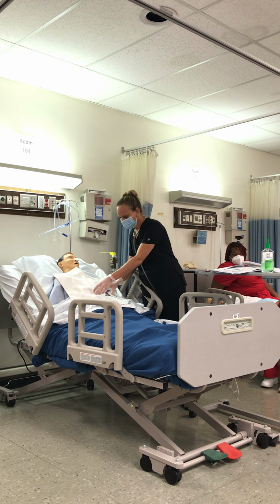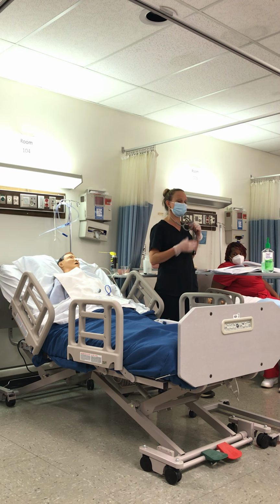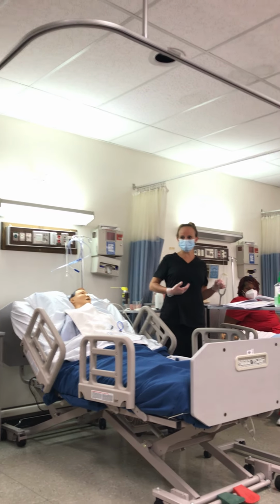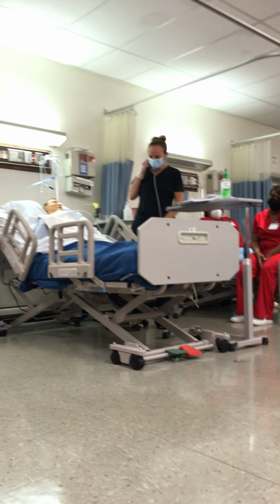So we're going to place that tube there. We're listening. Where's my stomach at? Okay, there's a stomach and there's an abdomen. Where's the stomach? That's pretty much the entrance, and then that stomach kind of lays off to the right a little bit, okay? Because our liver kind of comes over the top. But it's about right in here, okay? So we don't want to be listening down here.